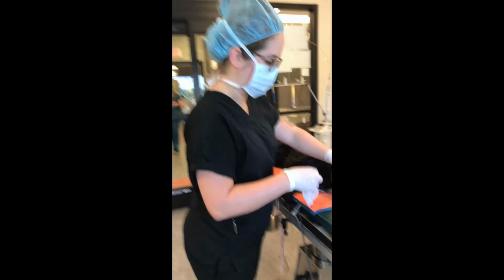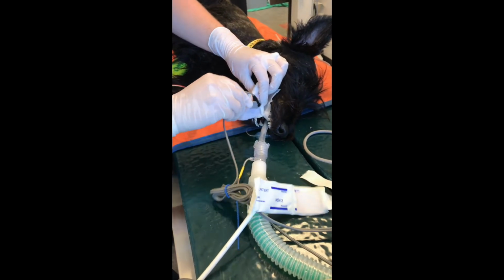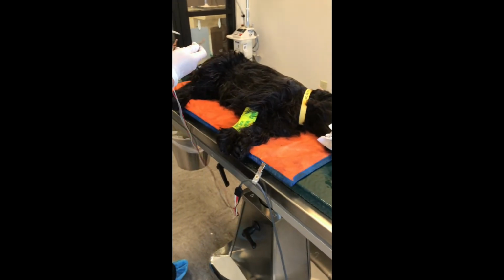Alright, so we have our patient anesthetized here. We're going to go ahead and hook him up to all of his monitoring. We have his pulse ox here. That's going to do his SpO2 and heart rate. Then we're going to do his ECG.